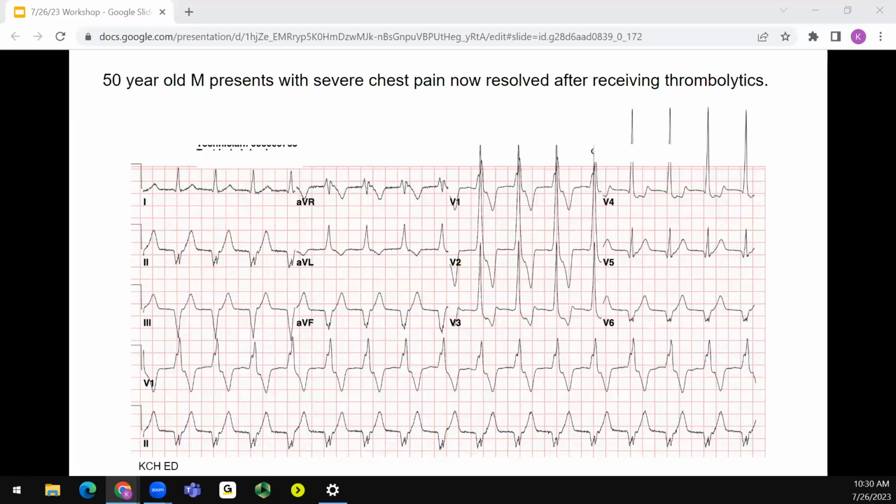What do you do with this? What if they're hypotensive? You still don't do anything. You give them pressors, you give them supportive care, and you expect this to resolve on its own. If you end up in the CCU, you might see this rhythm.